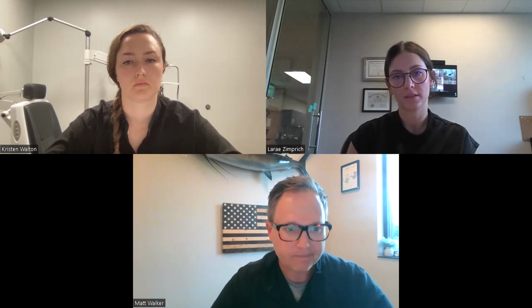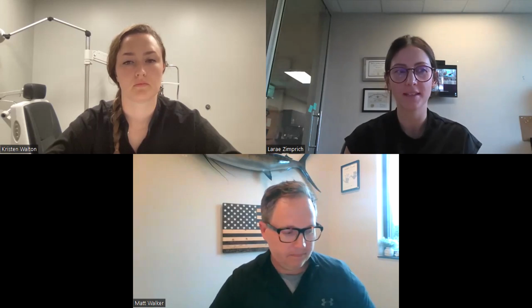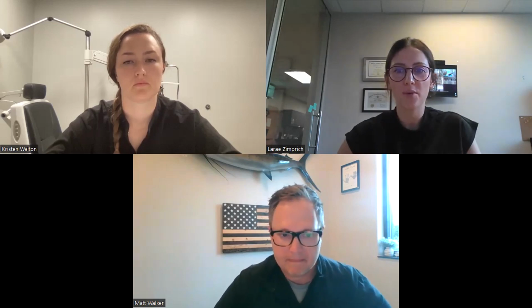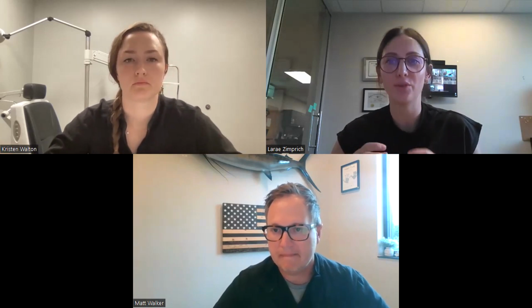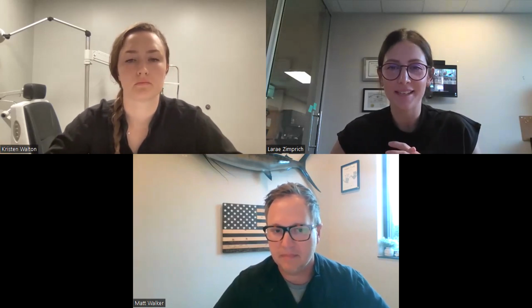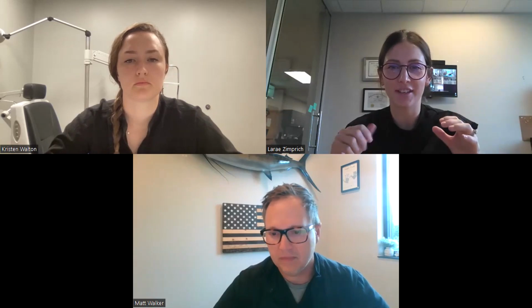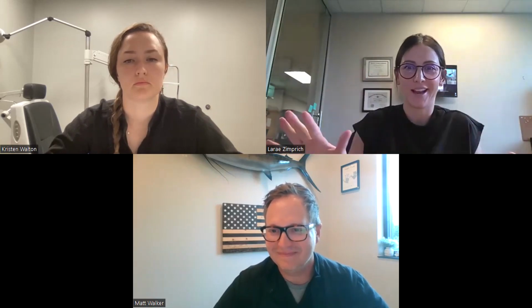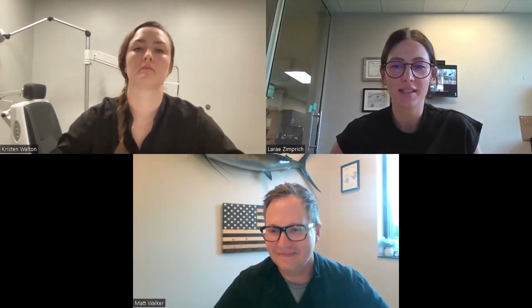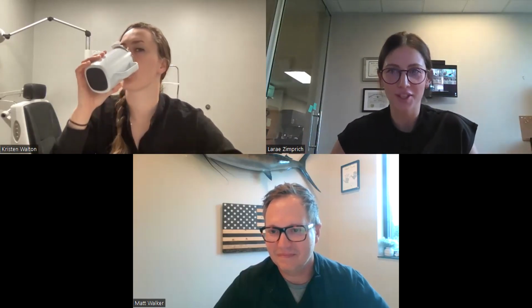Yeah, and I think that's one of the biggest things when they come in: how loose is that lens? The lens that's decentered, how loose is it? Is it just decentered and you're knocking on your slit lamp and the lens is staying right there, not moving, maybe it's been that way for a while? Or is it something that we're worried is going to fall to the retina within the next day?